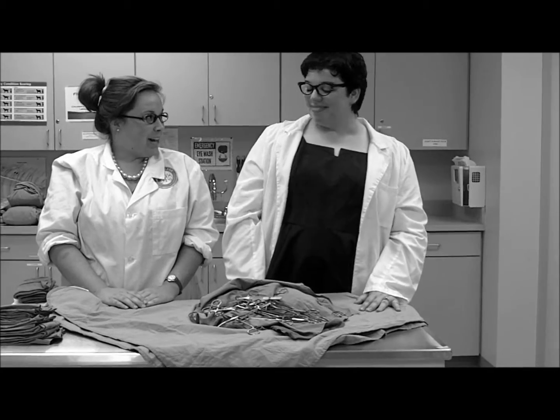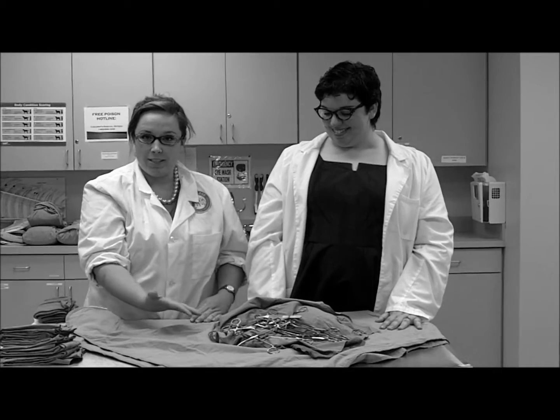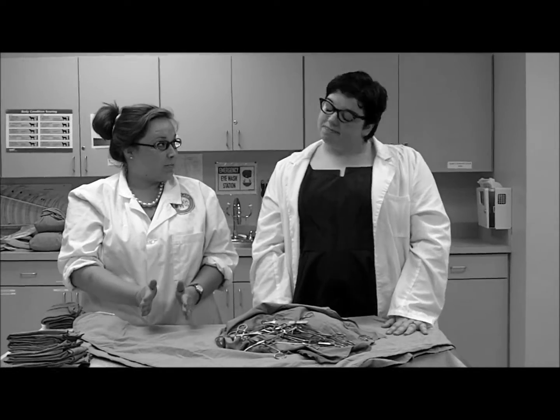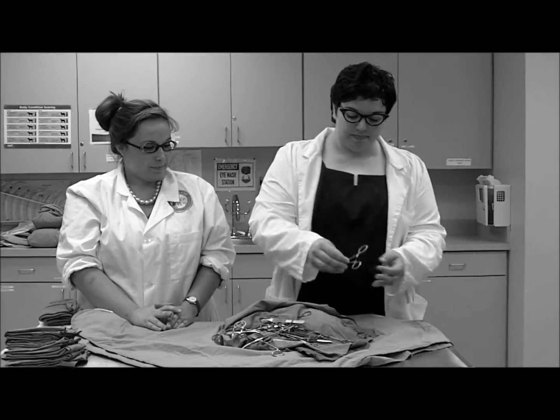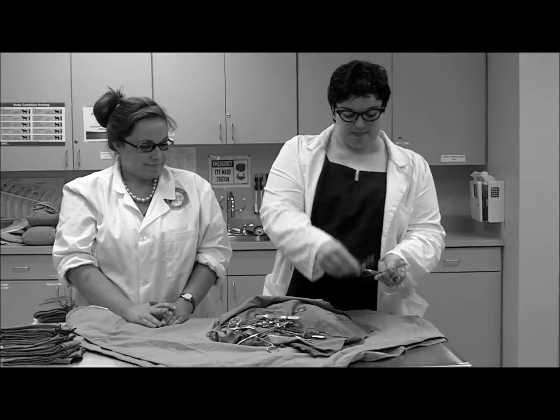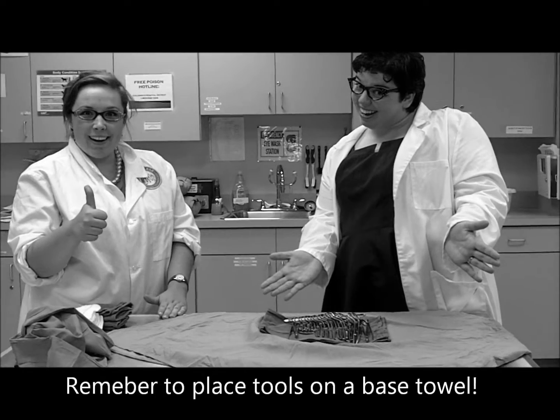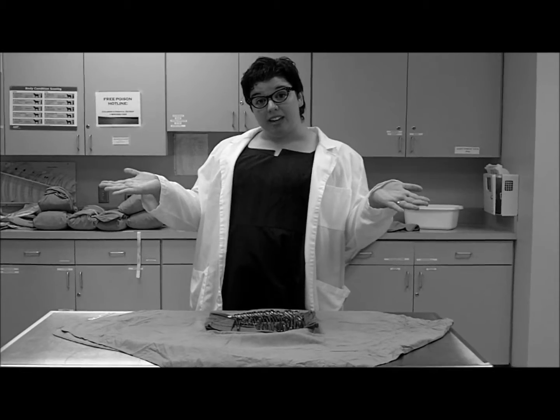The first step in wrapping a major surgery pack is proper alignment of all the tools. You begin from largest to smallest. Like this? Super! What do we do next?